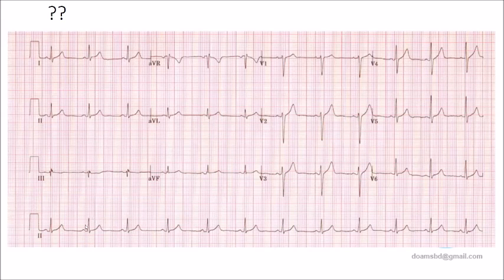So we can say that 300 divided by 4 is 75. A little more, so the rate will be less than 74, maybe 72. Right, Dr. Femina? Yes. Thank you.